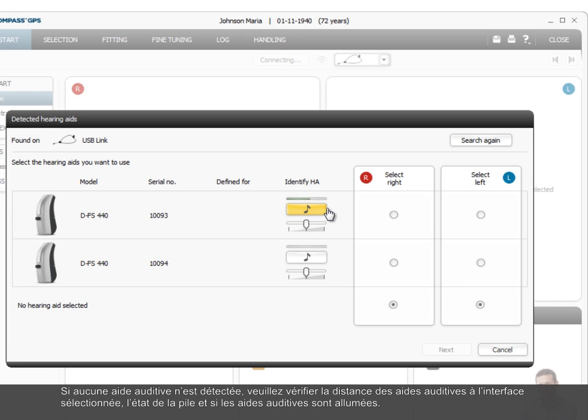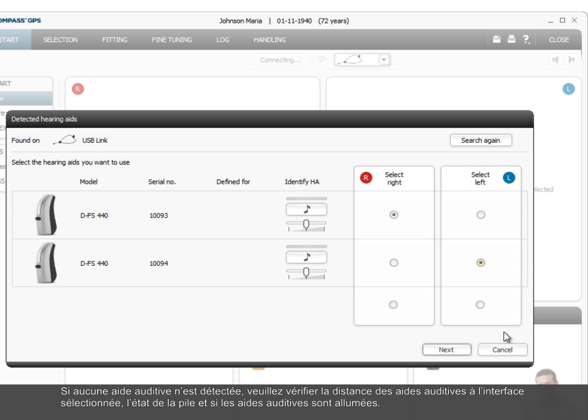If no hearing aids are detected, please check the distance of the hearing aids from the selected interface, the condition of the battery, and that the hearing aids are switched on.